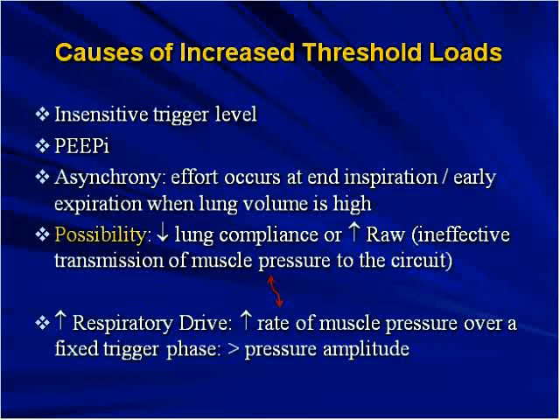We try to keep the trigger as sensitive as possible. Intrinsic PEEP is something we try to limit, and we sometimes will set the ventilator PEEP level to match that or come close to it to decrease the threshold loading.